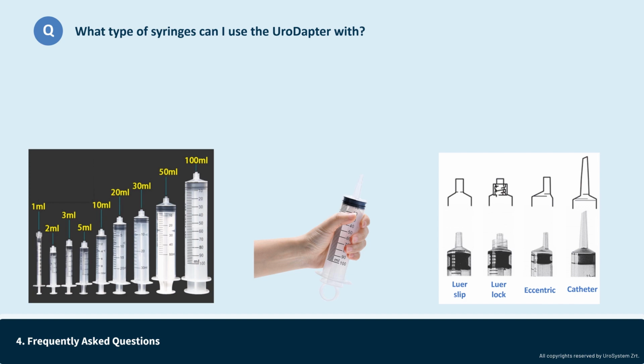In some syringes called eccentric, the Luer slip tip is positioned at the edge of the syringe to provide better positioning for surface veins or artery injections. And the final tip variant is the catheter tip, which is larger than the Luer tips and compatible with catheter or gastrostomy tube connections. These are mainly for flushing or cleaning catheters or tubes and are found on larger syringes, like 100 milliliter or above.